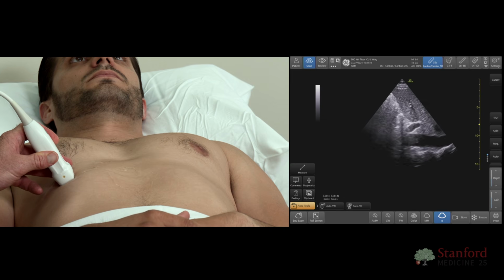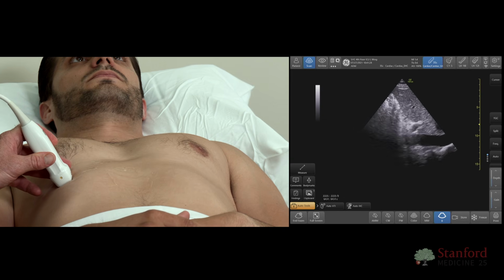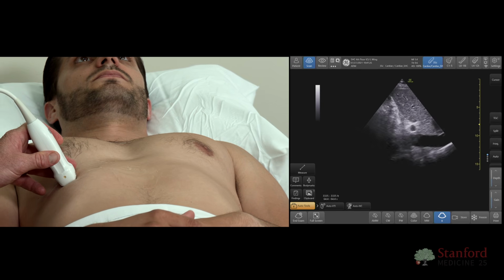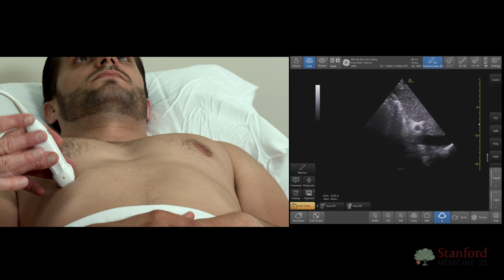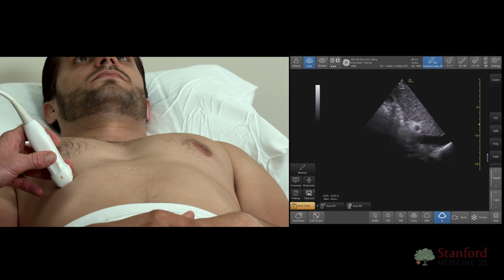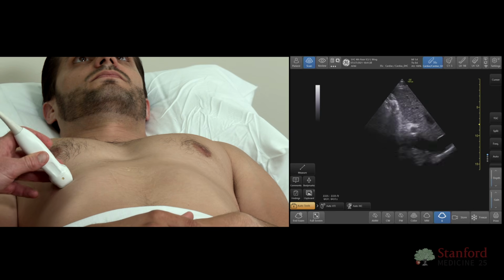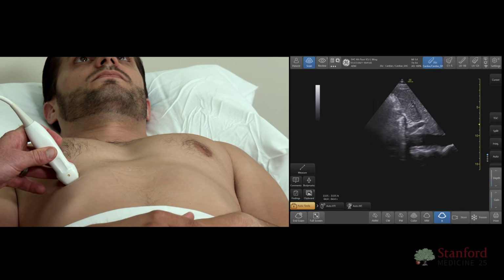Now, if you look at this picture, the problem is I don't know where in the IVC that I am. I have a general idea. But again, when we're trying to take good measurements, we need to measure the IVC diameter either 2 to 3 centimeters from the right atrium or right where the hepatic vein enters the IVC. That tends to be right in the same spot, okay? So if I just have any random spot on the IVC, I don't know where I am, so I don't know what diameter it should be. So I need to look around.